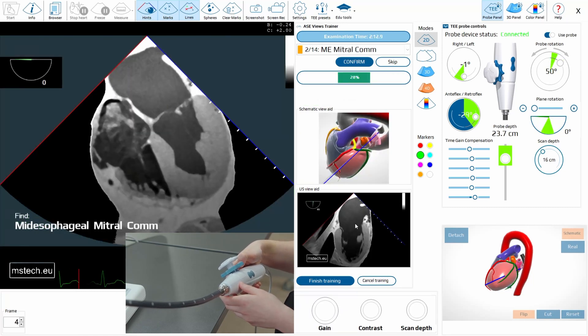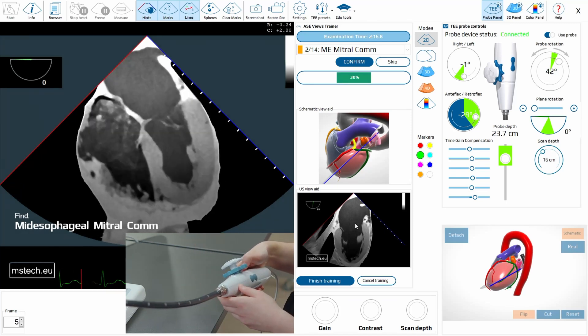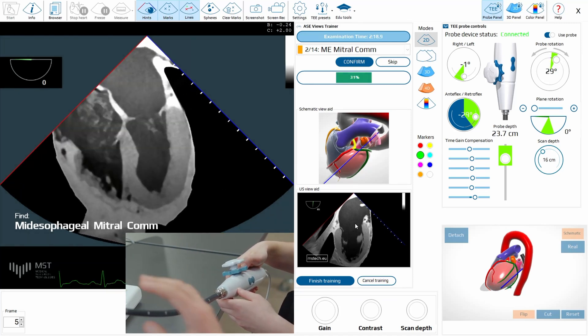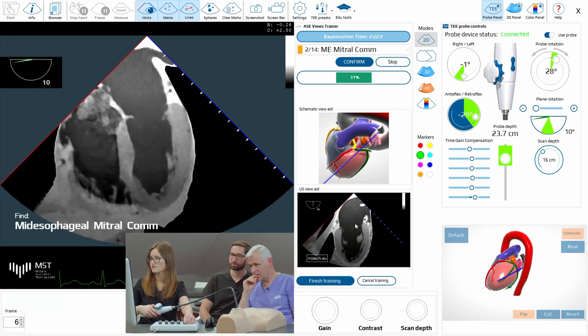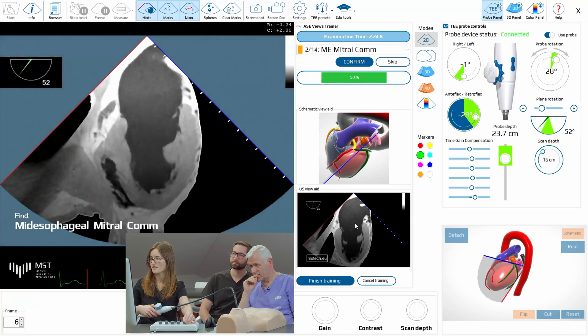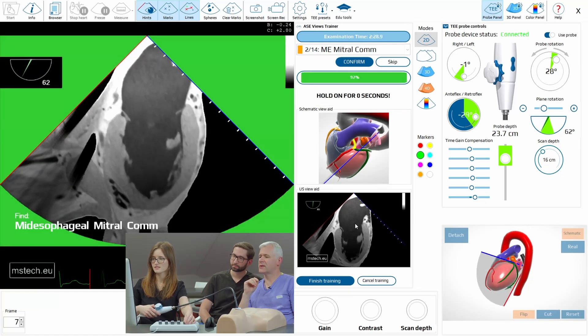Now intercommissural. I told you that we have to position the left ventricle in the center. And now go to 60. Now we change it here. You see? Perfect.